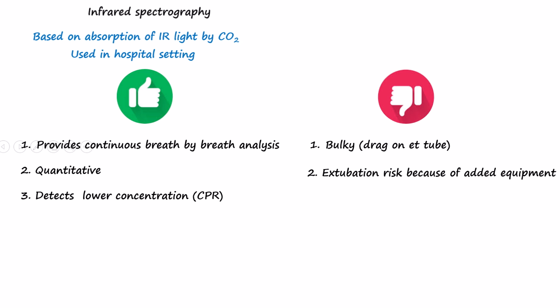Most capnography units require some level of maintenance and consumable supplies such as batteries and airway adapters. Lastly, the equipment is also expensive compared to the colorimetric devices.